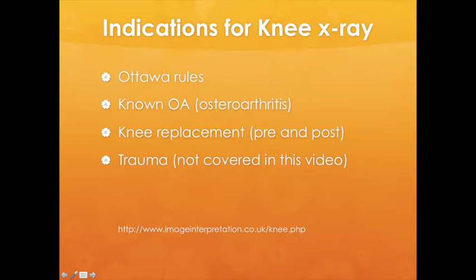Other reasons include known osteoarthritis, and if the patient is for a knee replacement, they will have pre and post knee x-rays. Trauma is another indication, however, we will not cover this as the positioning demonstrated should not be used in the trauma setting, as a horizontal beam method should be used to assess fluid levels in the fat pads.